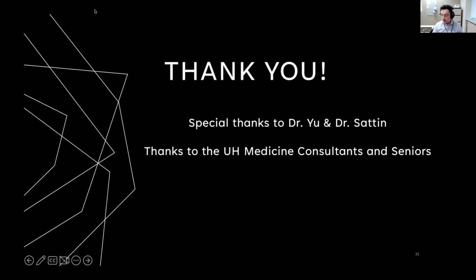Well, I'll just say, first of all, thank you, Jeremy and Qasim. This is a really wonderful presentation. I think you had gone through a very nice process of talking about the basic things that we started with, looking at LV basic systolic function, and then moving on to much more advanced hemodynamic assessments, talking about diastology. One of the comments I've had with you is that although we call this diastology, it's not really the purpose of what we're doing. We're not trying to look for or grade diastolic dysfunction because, as you alluded to, this is a very complicated topic with a lot of pitfalls.